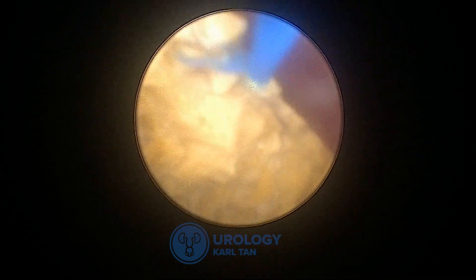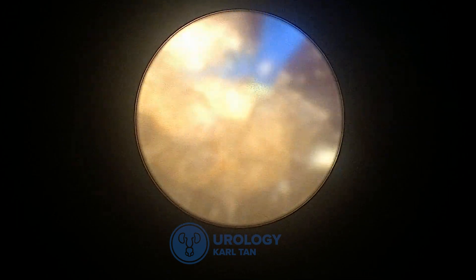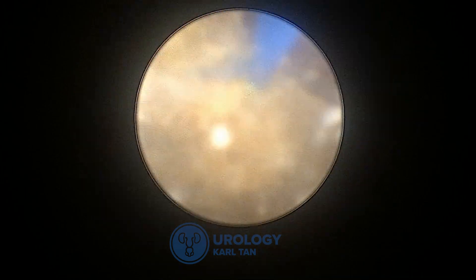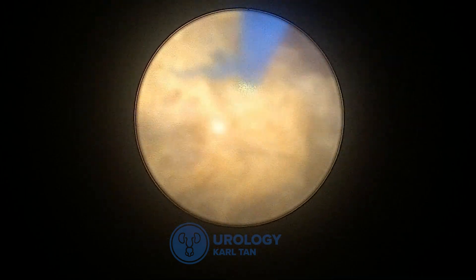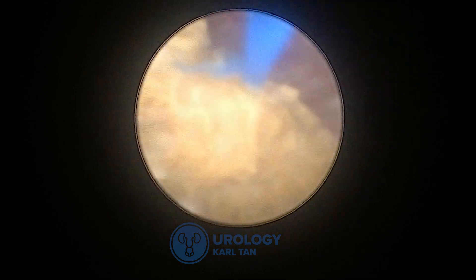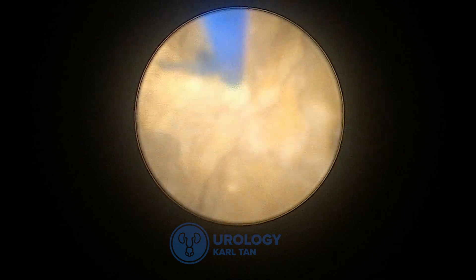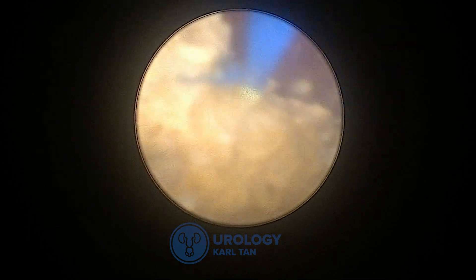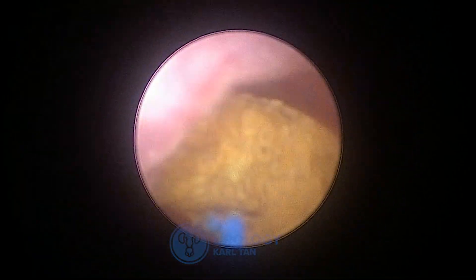We don't really recommend pushing the settings too high. The laser settings are actually dependent on the style of the surgeon or urologist using the laser. For me, in this case, I would prefer very low laser energy and keep my power at 10 watts to avoid heat increasing inside the compartment of the ureter.